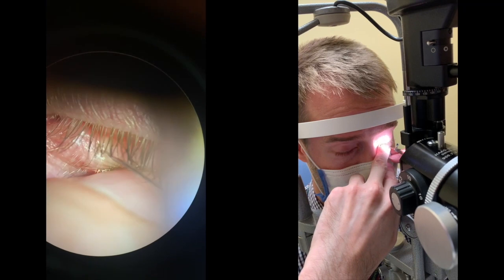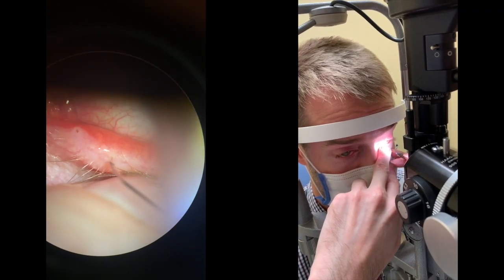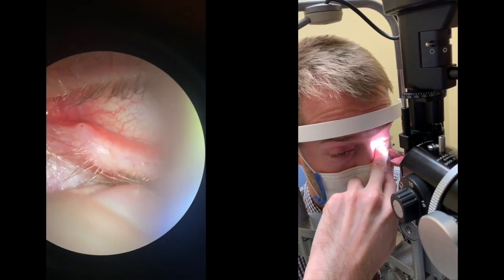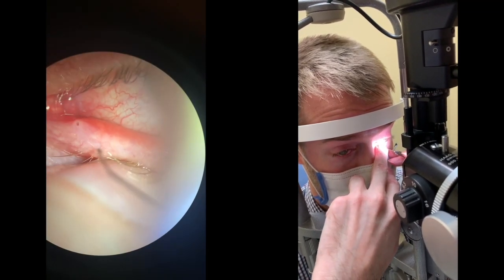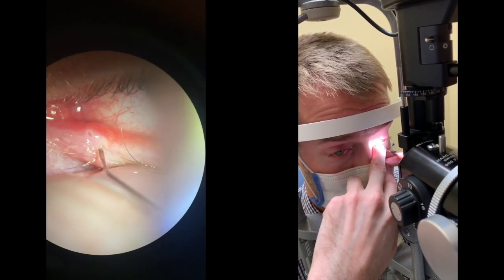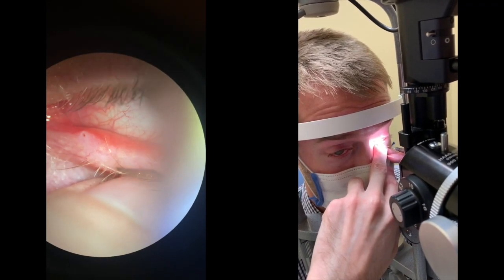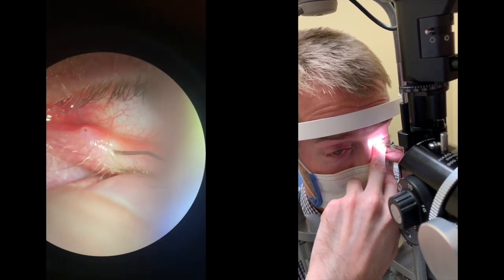I don't repeat meibomian gland probing very often — one reason being the discomfort of the patient, the difficulty of doing the procedure, as well as the length of it. I think once you've achieved some progress in the patency, that is usually enough.